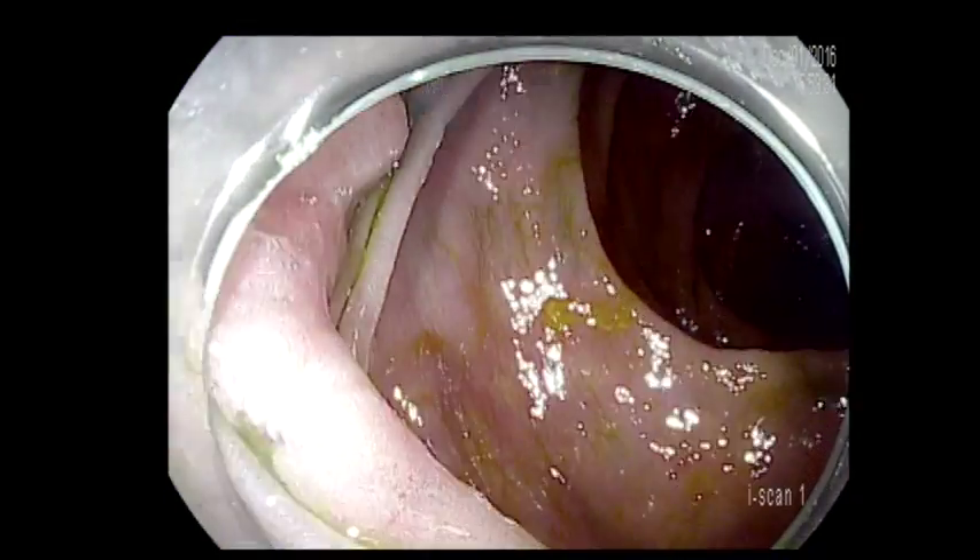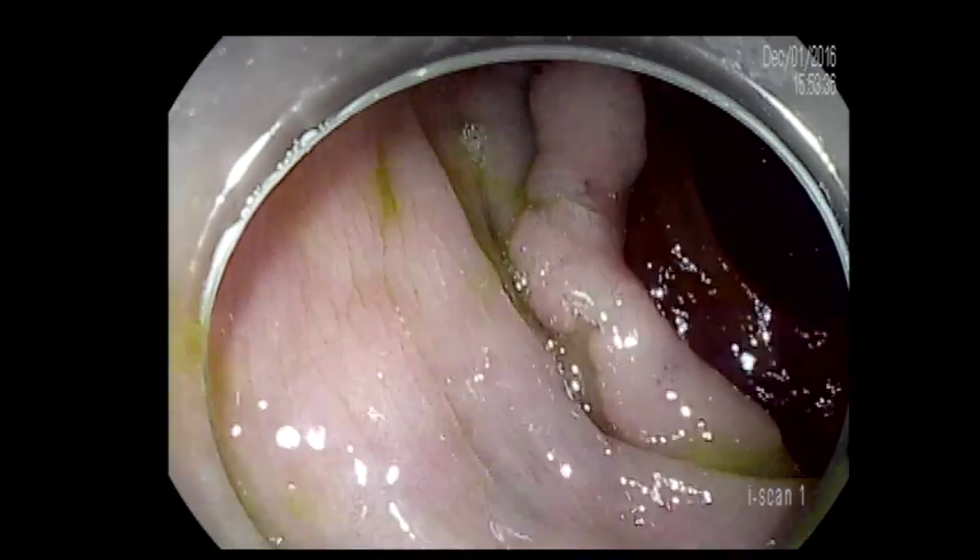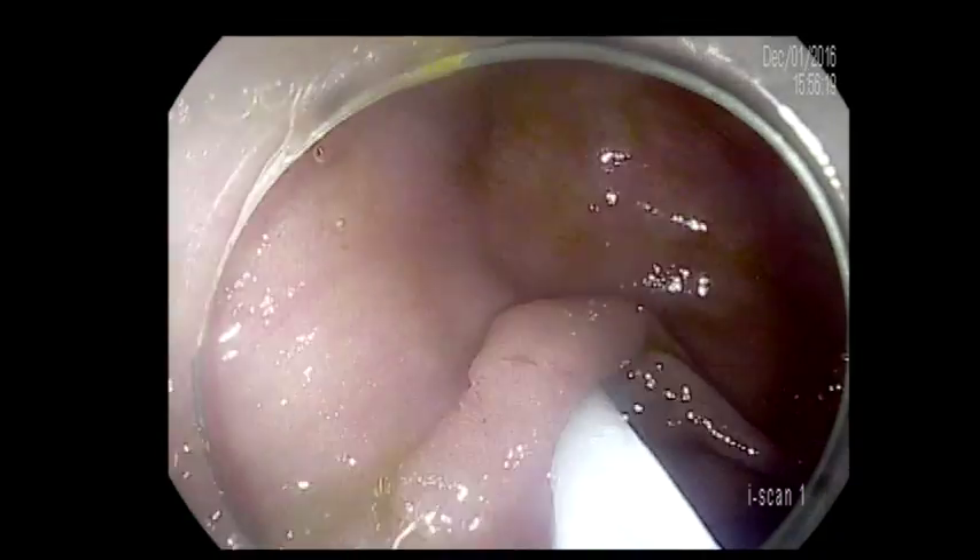It was a little bit difficult case. The patient was morbidly obese with a large flat polyp that's involving, as you see here, more than a third of the circumference in the right side of the colon. The positioning was not that easy, and I had to use pressure in order to get in a good position.